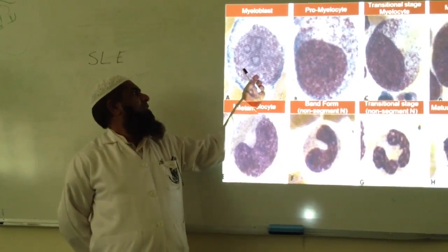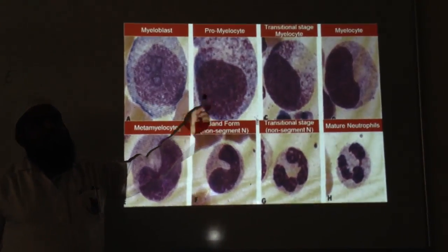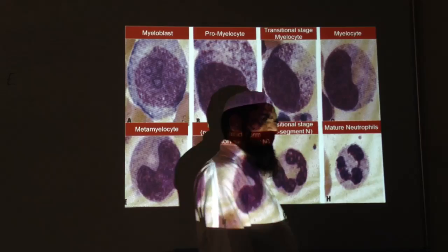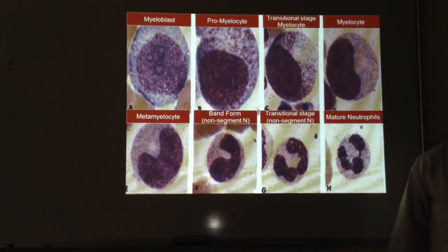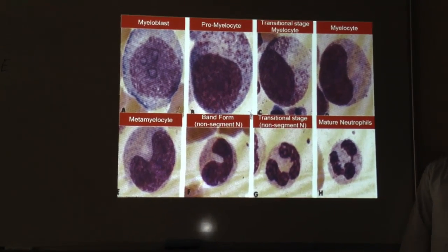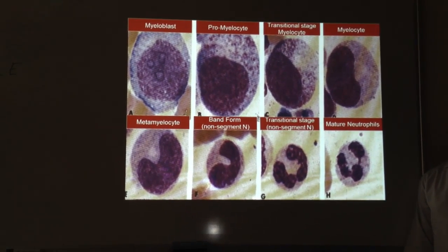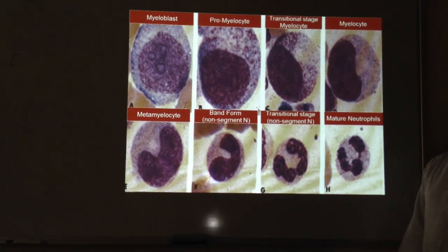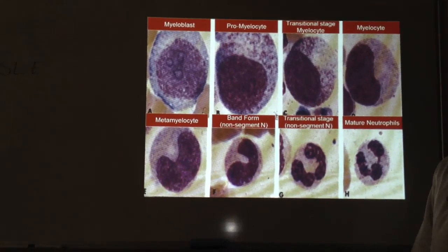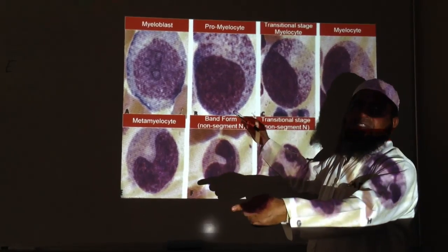Now, this will change to promyelocyte. What is the difference between myeloblast and promyelocyte? Yes. What is your name? Nucleus more mature, more granules. Main difference, see this. More condensed. In the actual slide, granules. Come here.